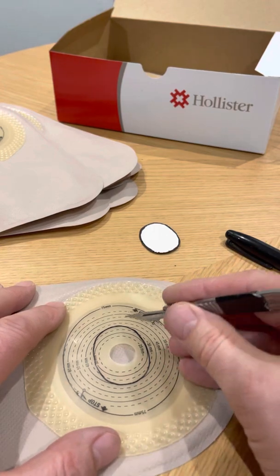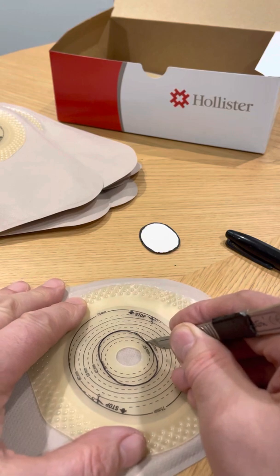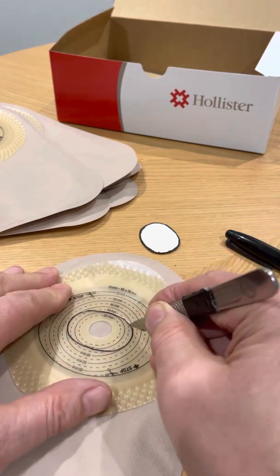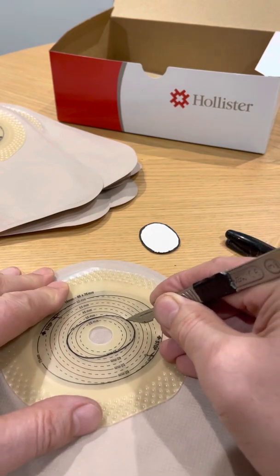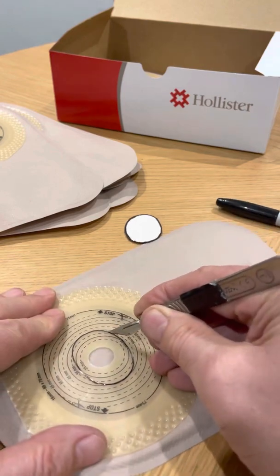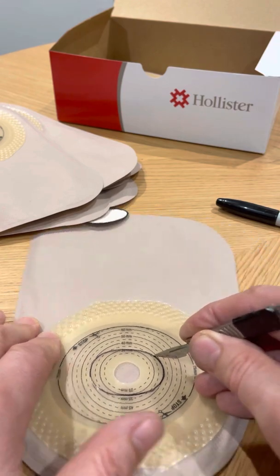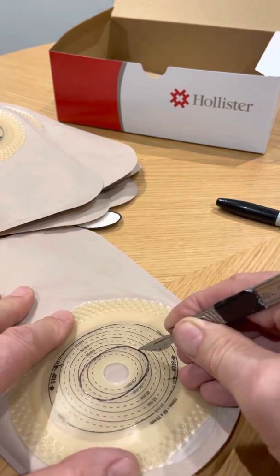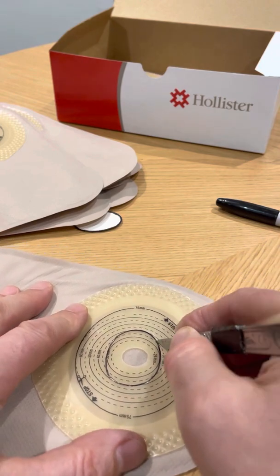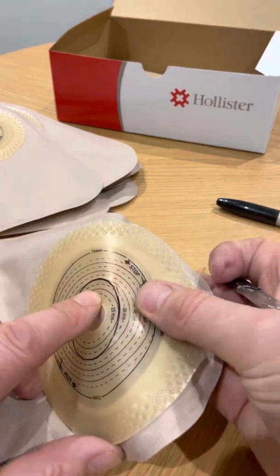So I'm just going to carefully cut around the line, and you may need to practice this on a couple. Be prepared to throw a few away until you feel the right amount of pressure, but actually it's hard to do it wrong, and you'll see how we can check it in a minute. Try and make sure you line up the final cut with the beginning where you started.